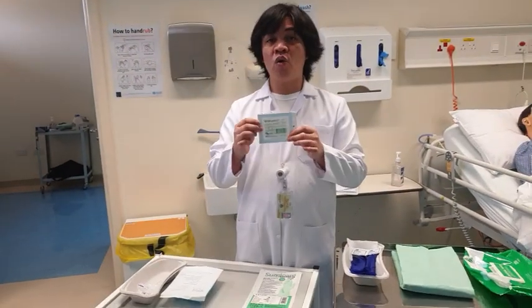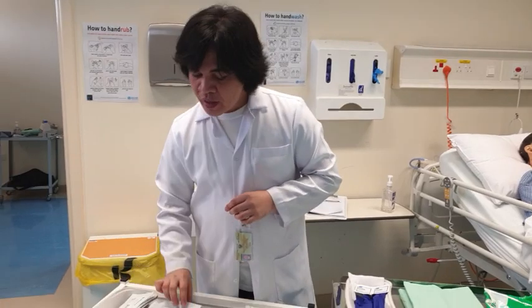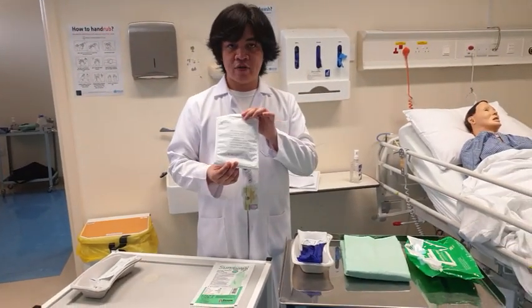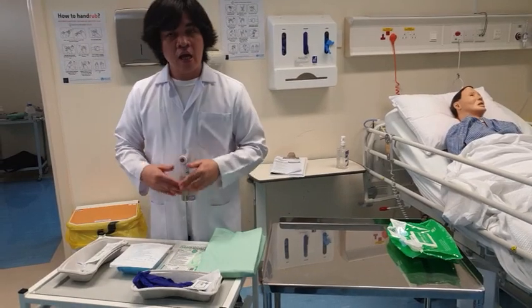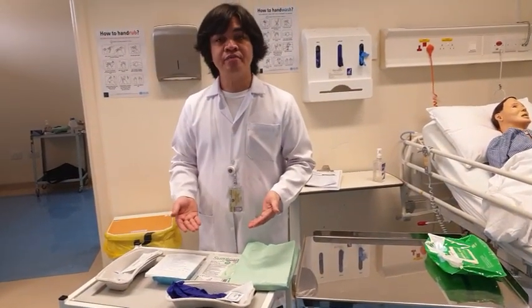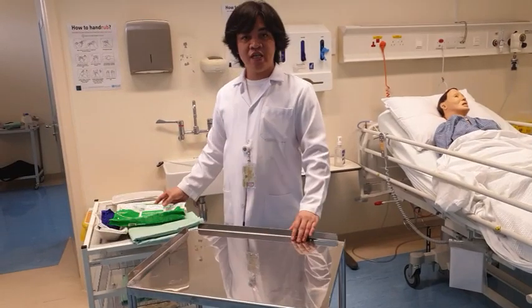This one will be used to cover the wound. We call this one Mepore or wound dressing. And most importantly, we should have the dressing pack or dressing set. These are the materials that we're going to use. And of course, you need to check if these materials are not expired. So how are we going to start now? Before you go back to the patient, the next thing that you're going to do is to clean your trolley.